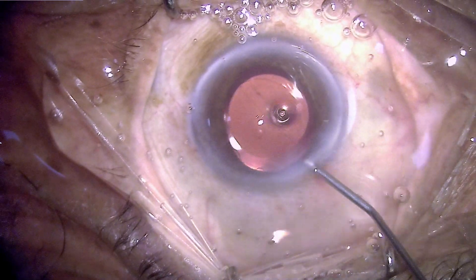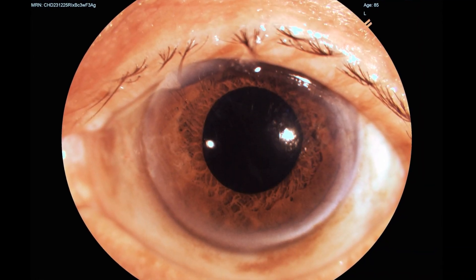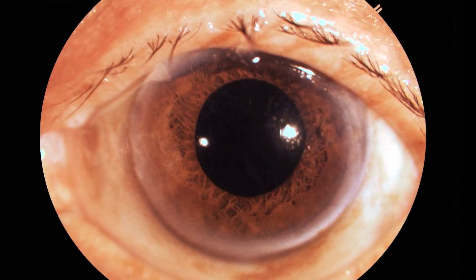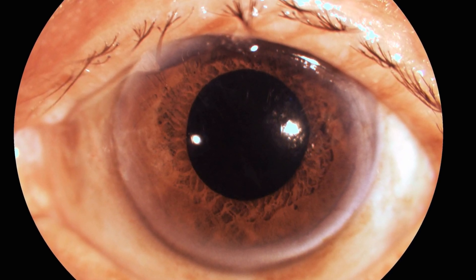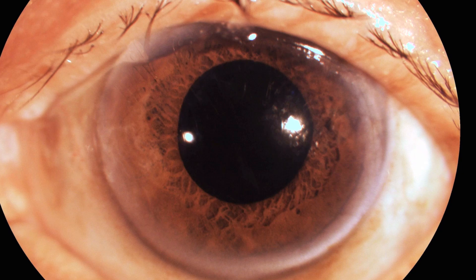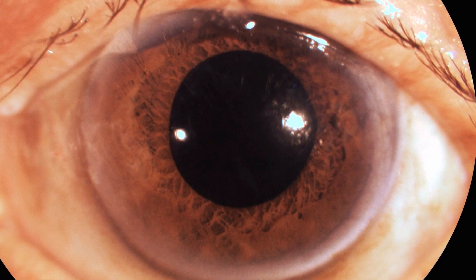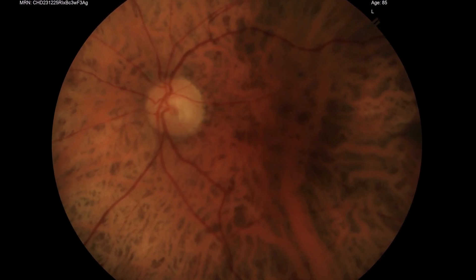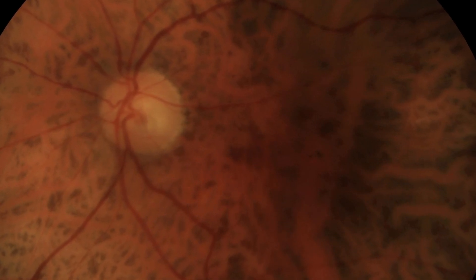Forming the anterior chamber — it's a long tunnel so it simply fuses and seals nicely. This is the next-day post-op picture, and we can appreciate that the cornea is crystal clear with no keratitis in spite of such a hard cataract. As I have said, the key contributory factor was that I chopped the pieces into smaller chunks so that removing and emulsifying them did not involve any touching or invasion into the anterior chamber that could contact the endothelium. If one can follow these steps, each one of us can achieve a crystal clear cornea even in a hard cataract.